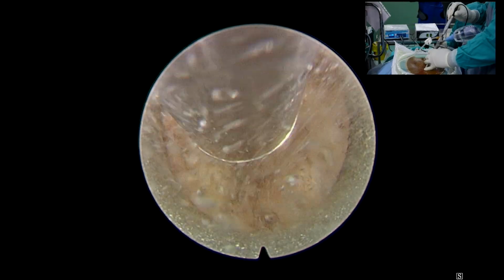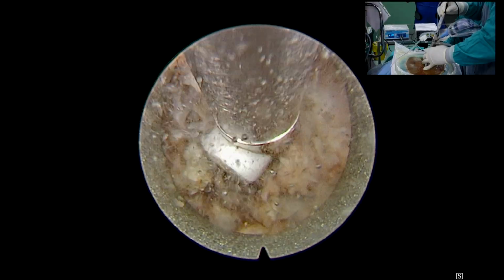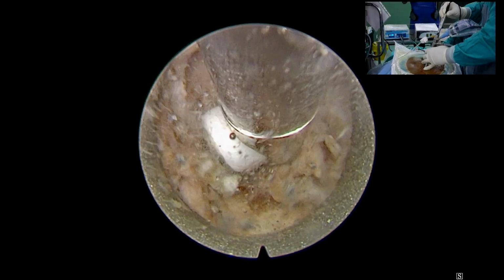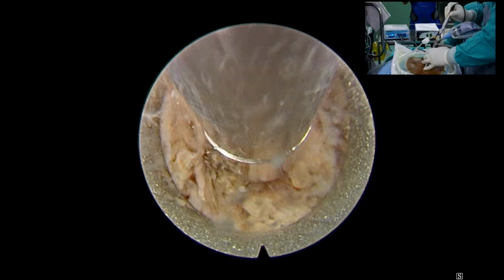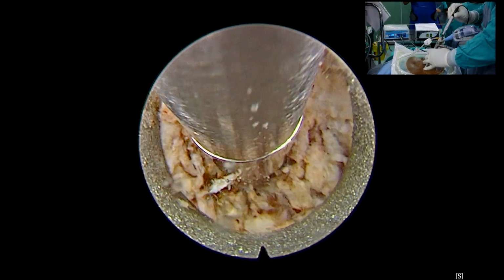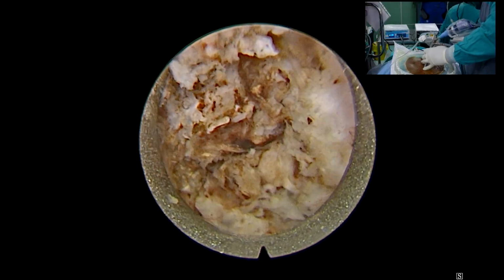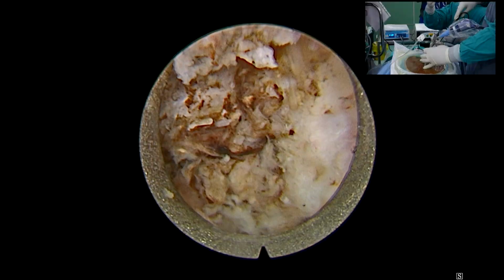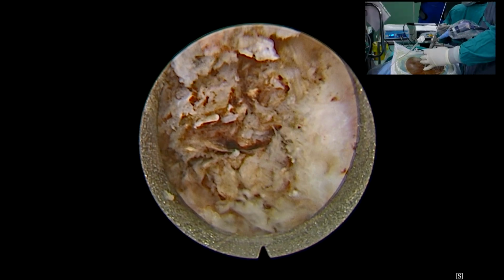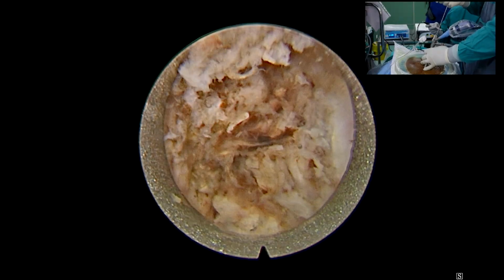We need a larger burring. So better we clear all the bony window and start the burring, and make a margin clear in our mind of how much area we will burr. Do not do over burring, and do not burr more around the pars interarticularis and make it prone to further listhesis.